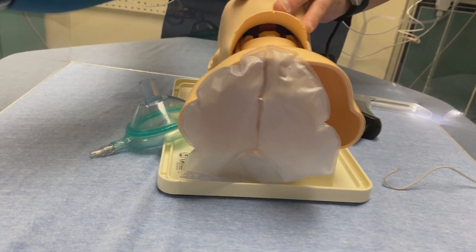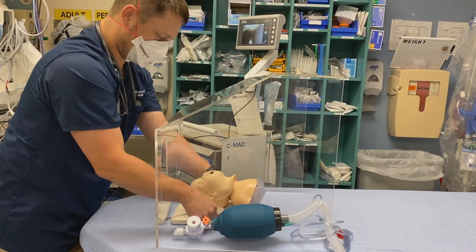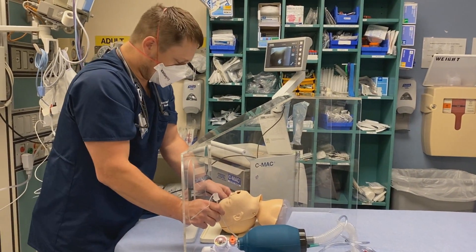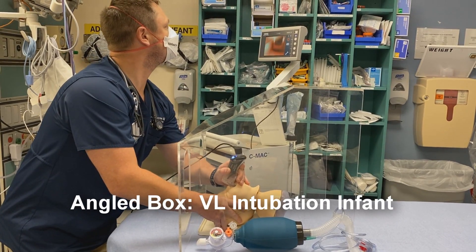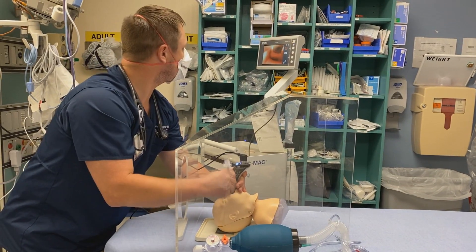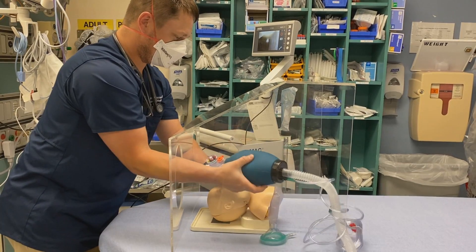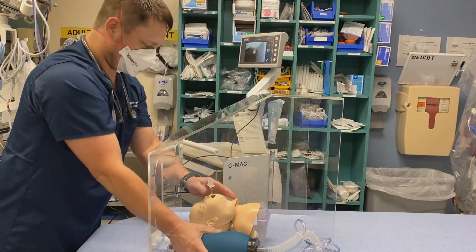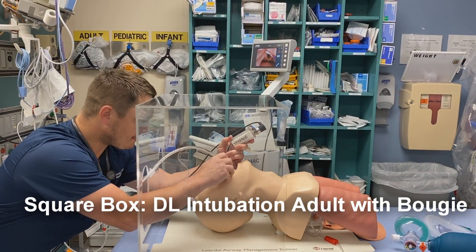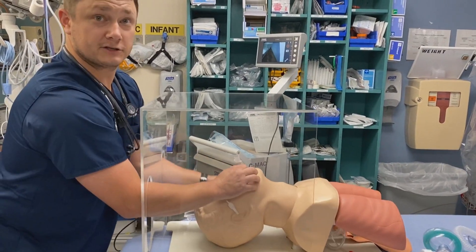We have good lung visualization — that was very simple. I think even under video, the ease of intubation with the screen involved in a positive COVID patient, or any respiratory illness with droplet concern, would be fairly simple. I was a little bit too deep there but easily backed out. I think that was a pretty dynamic intubation — pretty slick.